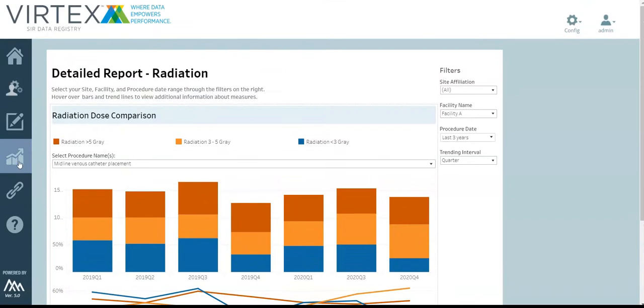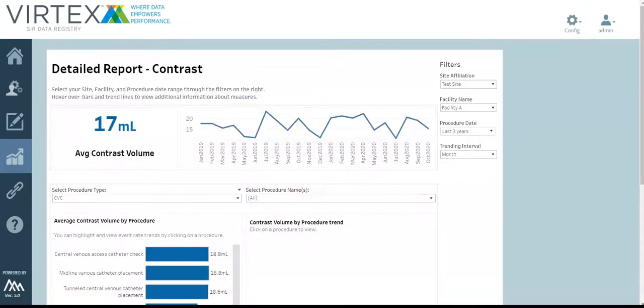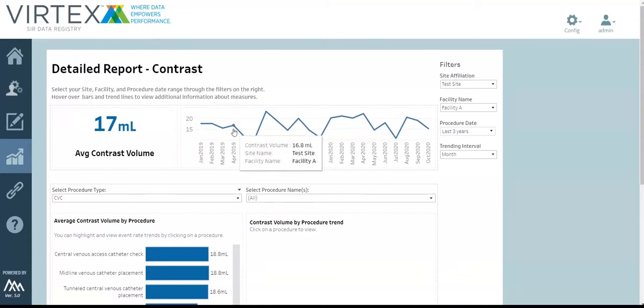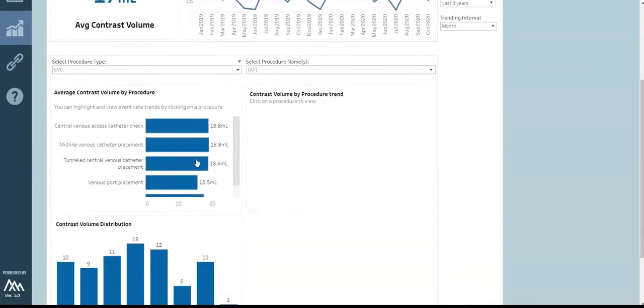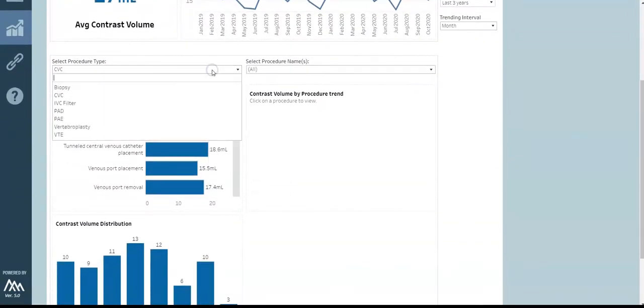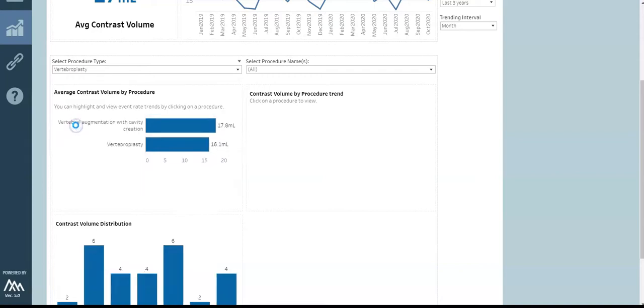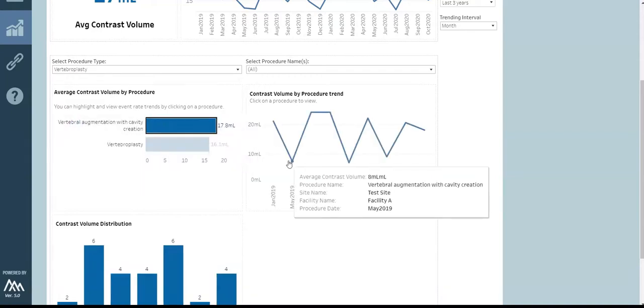Let's look at the contrast detailed report next. Here, you can see the average contrast volume trended over time for the selected sites. Hover your cursor over the trend chart to see the specific values. Again, you can select your procedure type and procedure name. Click the bar icon of the average contrast volume by procedure to see a trend chart over time.